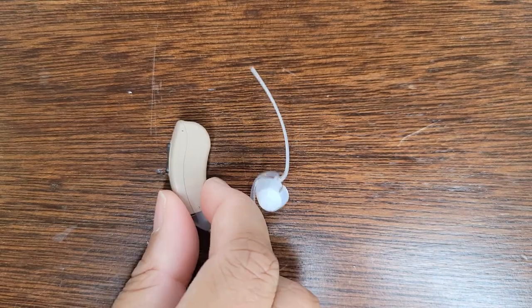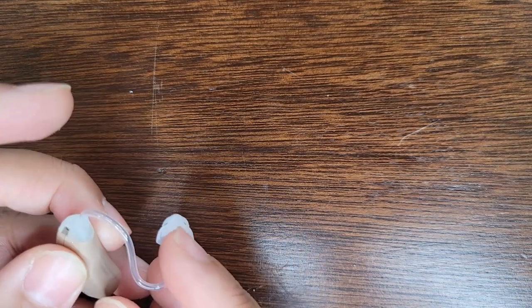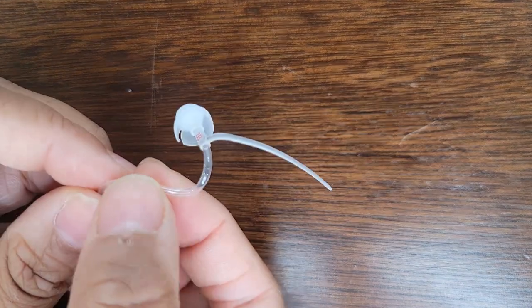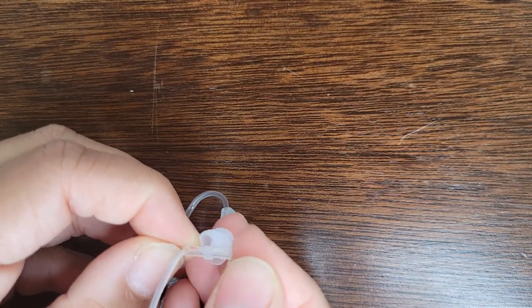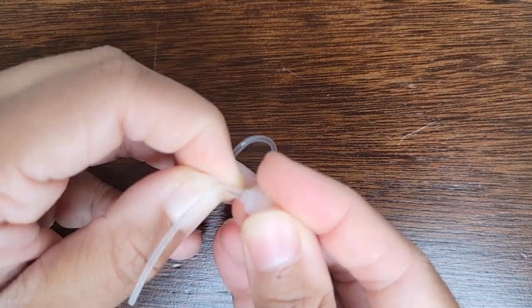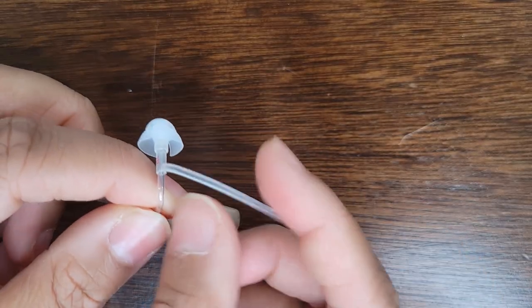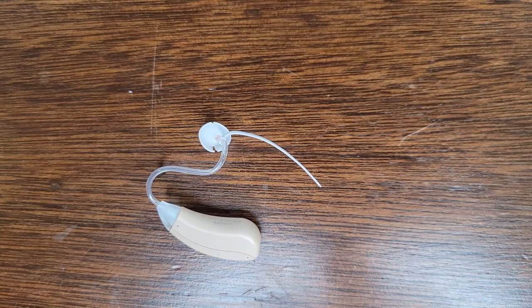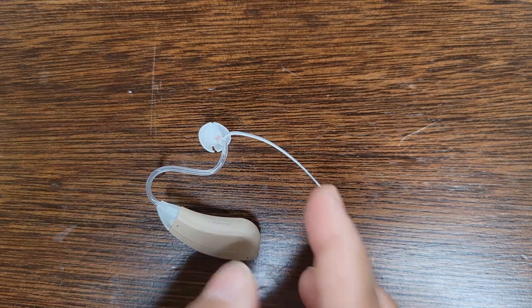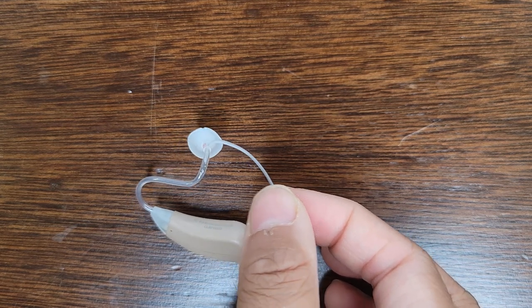So this is what one of them looks like. We'll go through some of the key features of this hearing aid. So over here, this is our thin tube. And then we have our domes attached right here that you can switch according to your size. And then this is called the stabilizer. Basically, you put this inside your ear to make sure that the hearing aid stays in place. You're able to adjust the stabilizer and cut it if necessary.